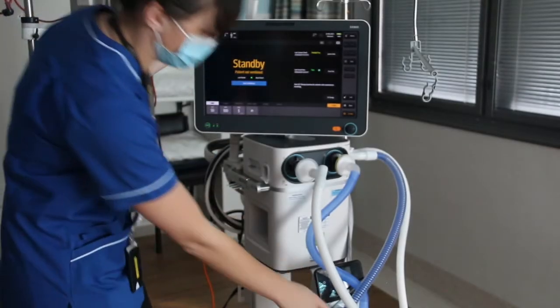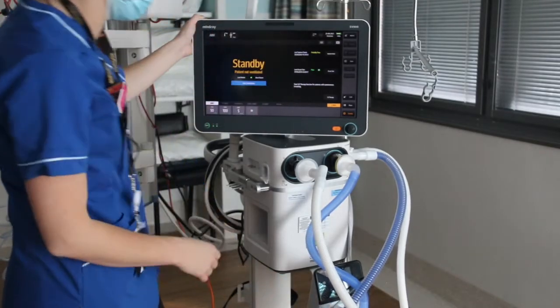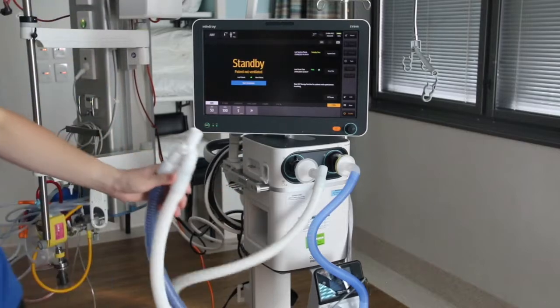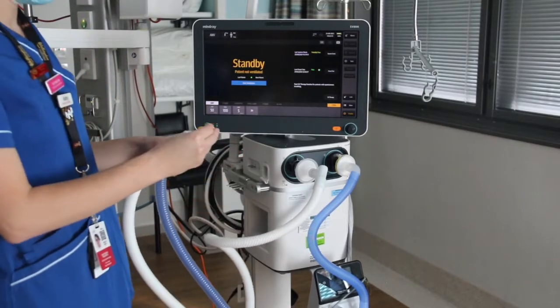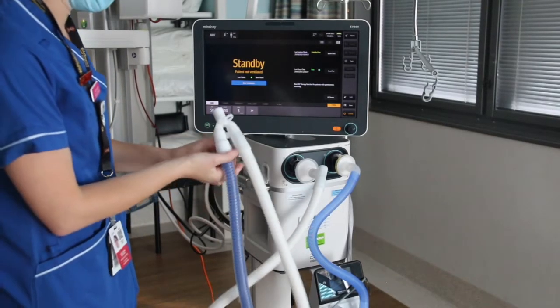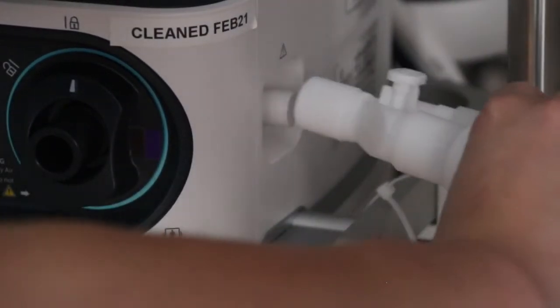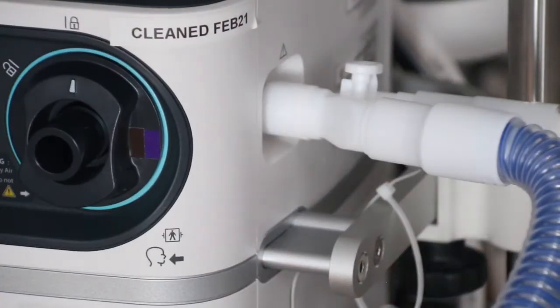So first things first, once we've got the tubing all set up and clicked into the humidifier, the end of it needs to be occluded. You can either do that by using the attached cap that comes in the packet, or you can pop it on the edge of the ventilator here — there's a blunt port specially designed for occluding the end of the tubing, so you can just attach that there.